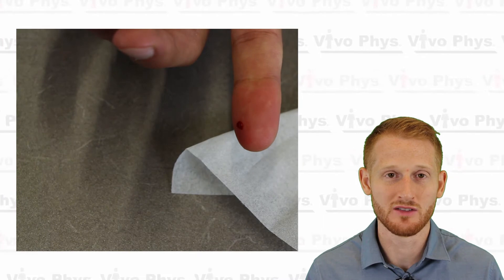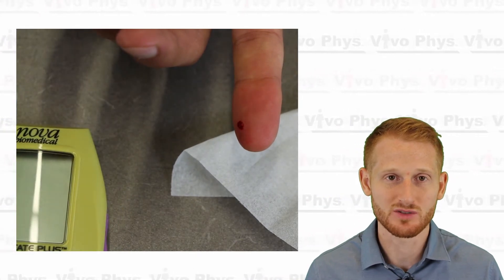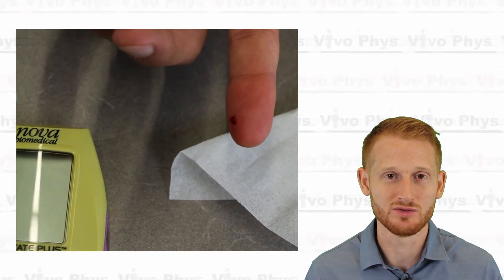Once you have done that, you've wiped away that first drop of blood, squeeze another drop of blood out and then you're ready to use that drop of blood. So the reason we wipe the first drop of blood away is because it's going to have a little bit of alcohol residue in it and that can mess with some of the measurements that you might want to do.